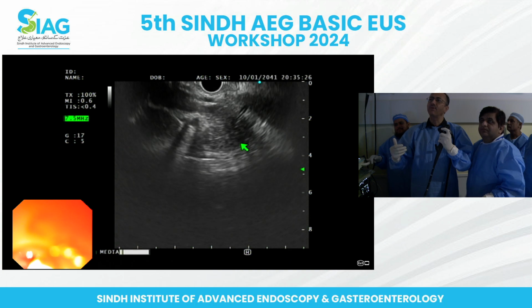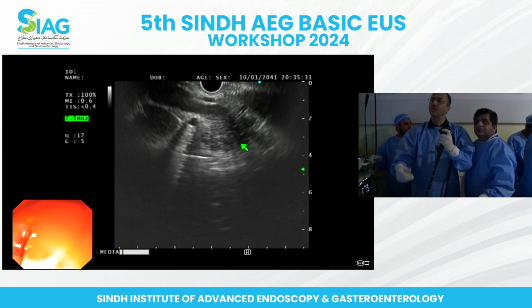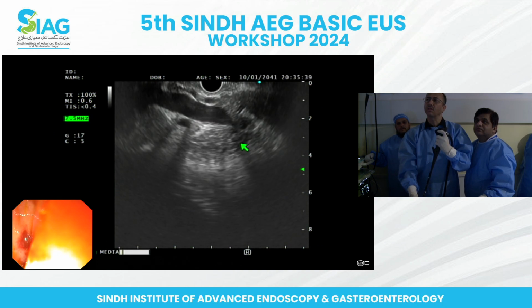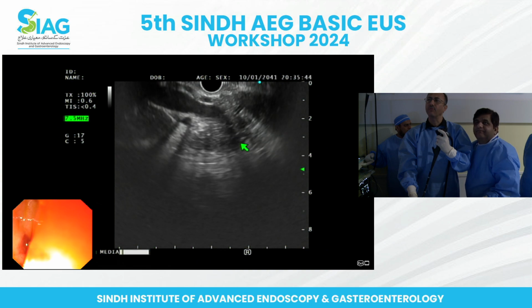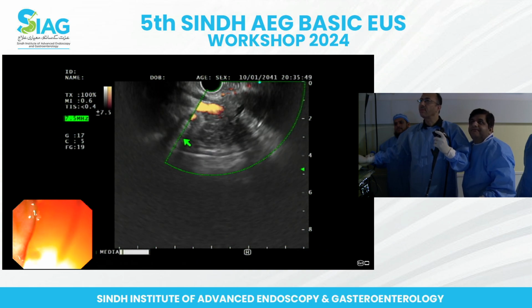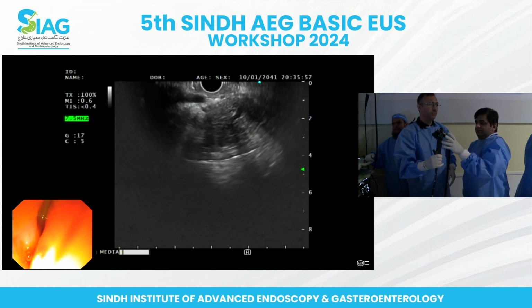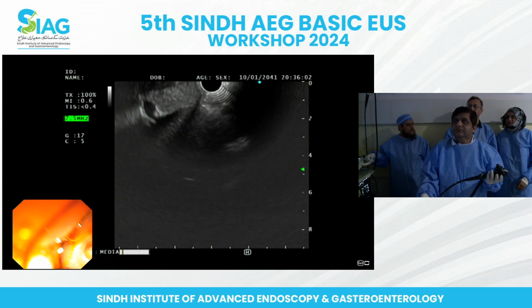So you need to know how to identify the portal vein. The moment you've gone inside, the first big structure with a flow of blood should be the portal vein. On top of that, most likely we have the CBD. So generally, try to bring the portal vein once again.